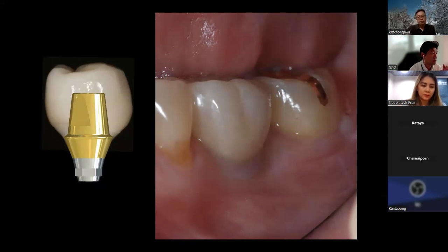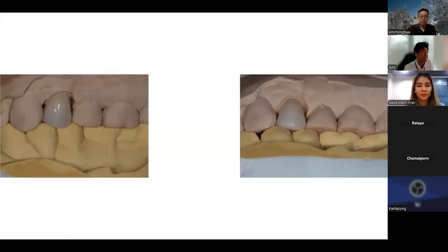What happens a lot of times, especially with little experience with implants, is that when the prosthesis has really strong contact, if you're not careful enough trying to adjust the contact properly, it remains very strong contact interproximally, and it won't get seated all the way down.